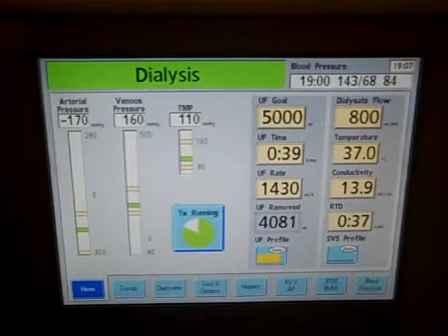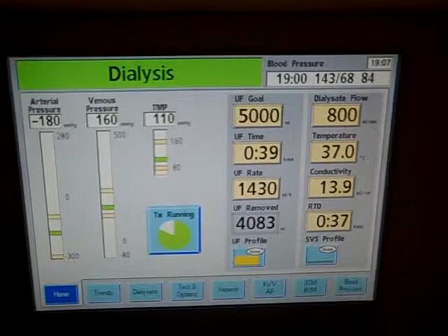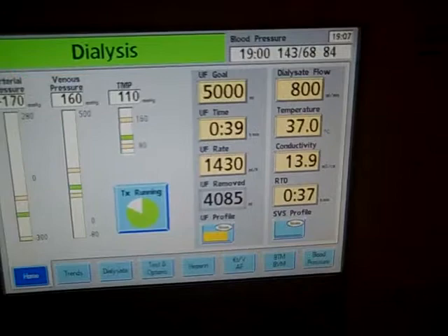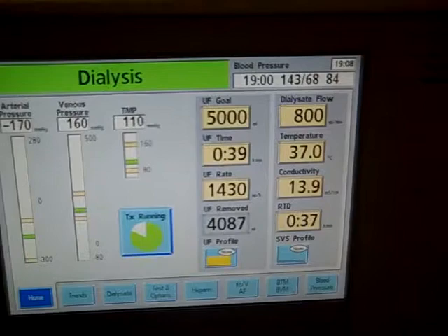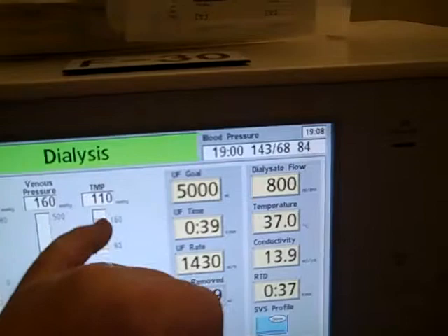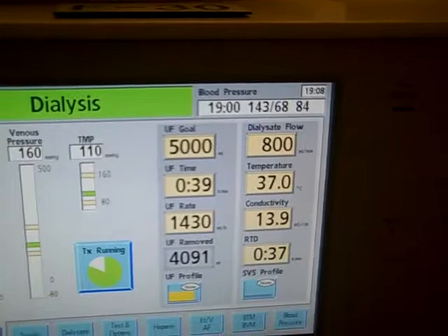On the screen here you can see various things. We talked about the arterial pressure that the pod was measuring — his arterial pressure right now is negative 180, and the cutoff point we're looking for is negative 250; we don't want it to exceed that. Venous pressure is 160 and it can run up to 250. You can see how much of his treatment he has completed. This is the transmembrane pressure we were talking about that allows fluids to pass back and forth through the membrane in the dialyzer.